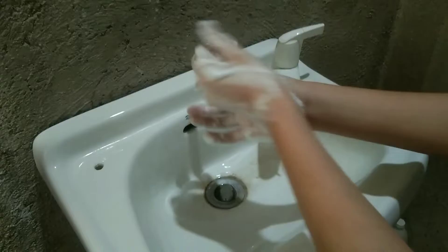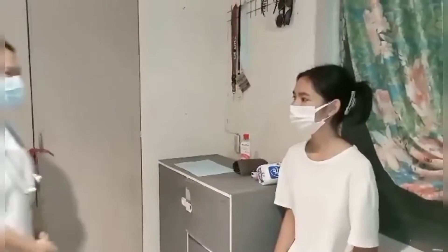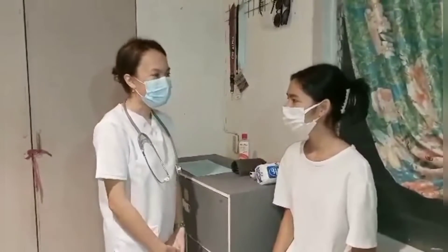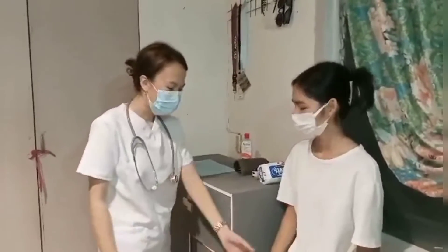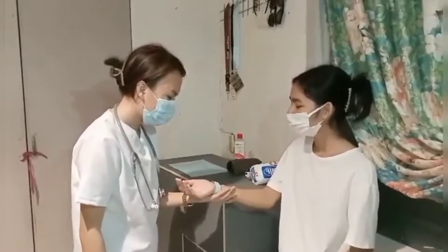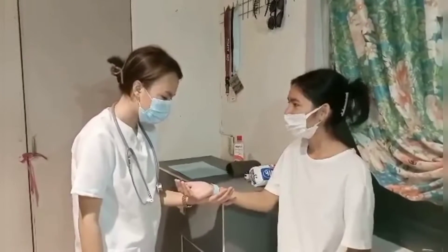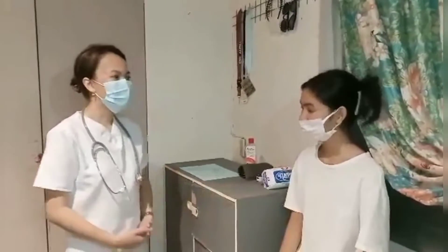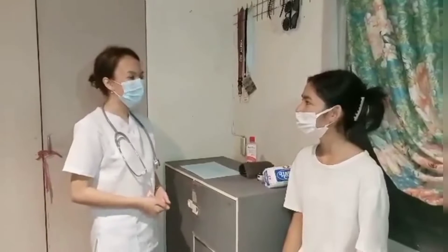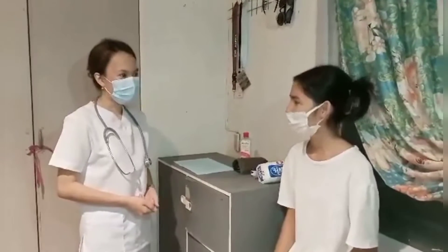Prior to the procedure, make sure to perform hand hygiene to prevent the spread of microorganisms. Good morning, ma'am. I am Shine and I'm your nurse for today. Can you state your name, ma'am? I am Russia K.I. Sarita. Your birth date? My birth date is September 29, 2002. So what we're going to do today, ma'am, is I'm going to take your vital signs. Is that okay with you? Yes, it is okay with me.